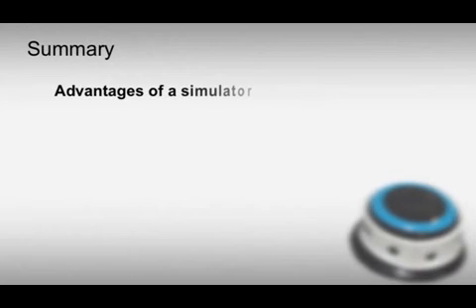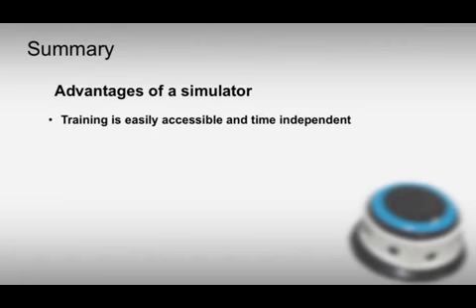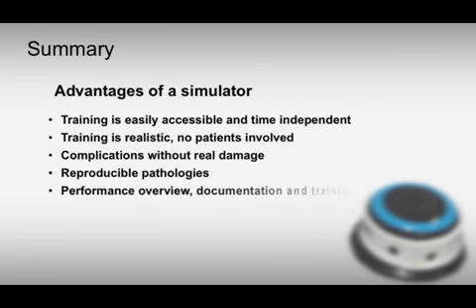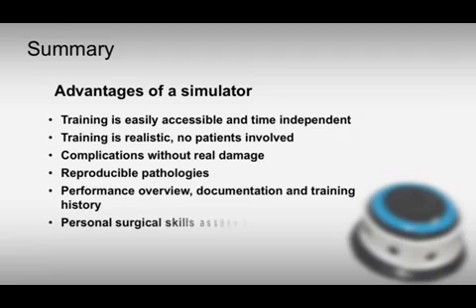In summary, there are several advantages in using a virtual simulator for education. The training is easily accessible and time independent. The training is realistic even though no patients are involved. Complications without real damage. Pathologies are reproducible. The performance overview helps to analyze and record the training success. Personal surgical skill assessment is possible.